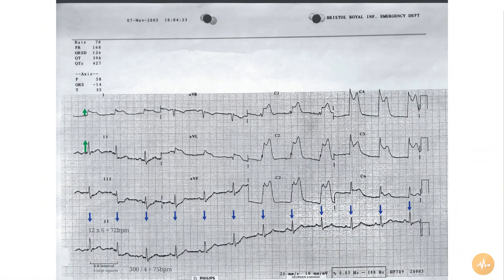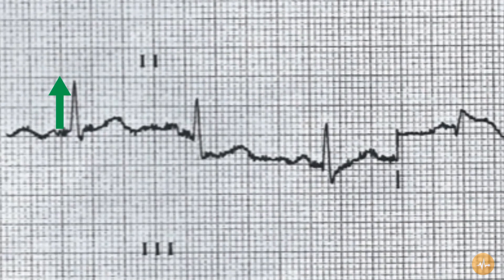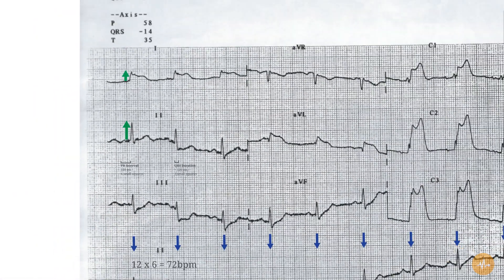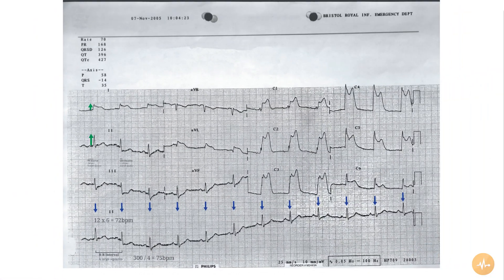The P waves are present and normal in morphology across the whole ECG. The PR interval is normal at 4 small squares. The QRS duration is normal at less than 3 small squares. And there are no pathological Q waves present.